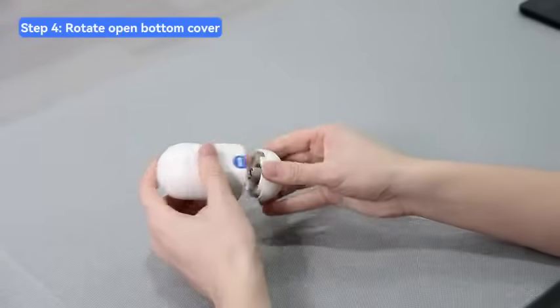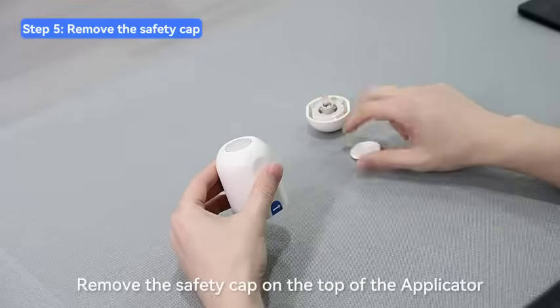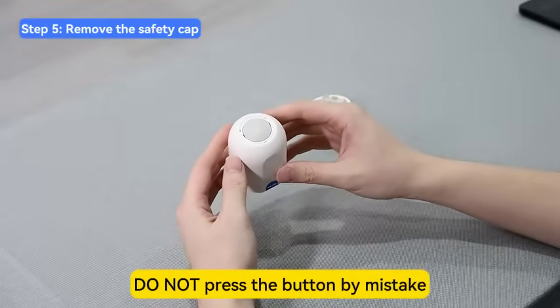Rotate to unscrew the bottom cover of the applicator. Remove the safety cap on the top of the applicator. Do not press the button by mistake.